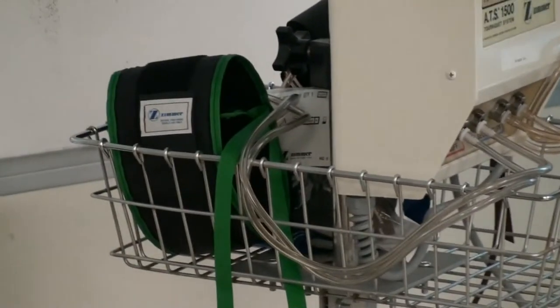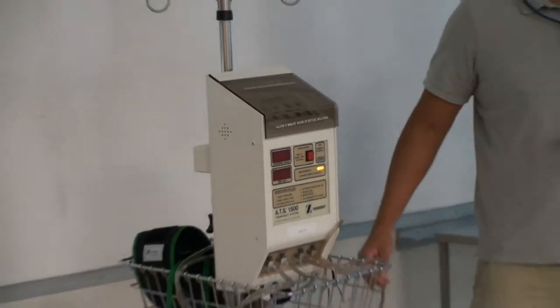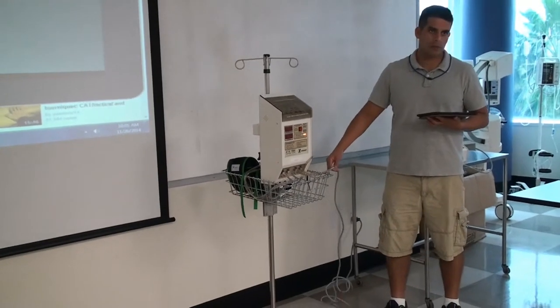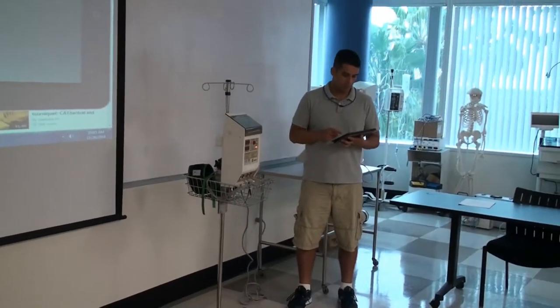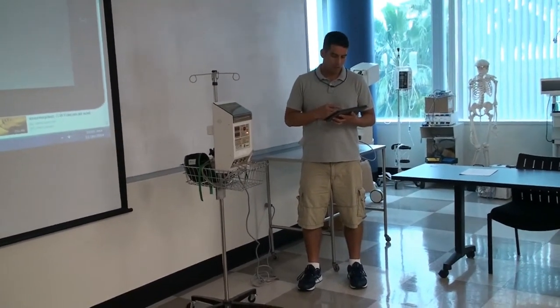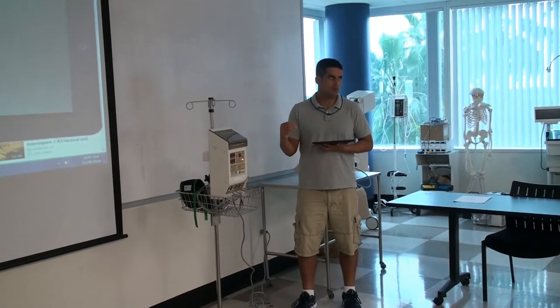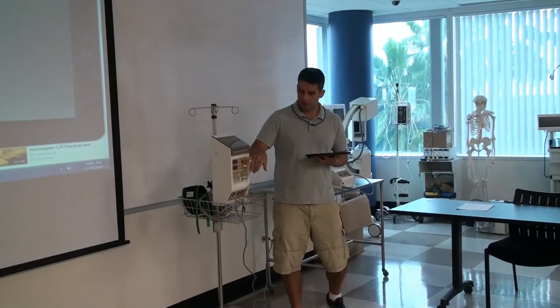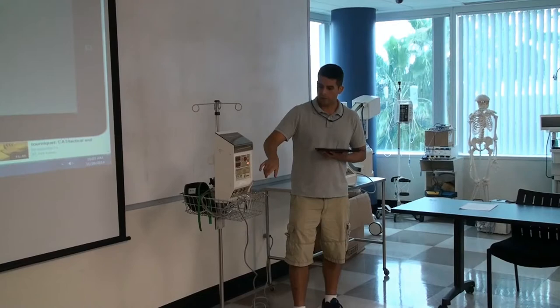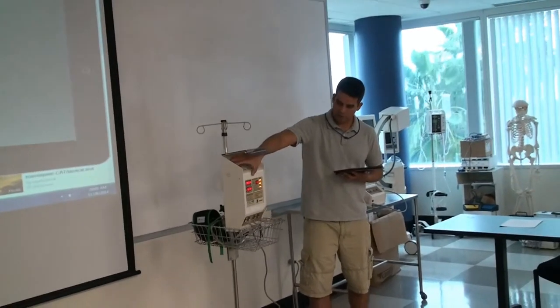For the troubleshooting, loss of power: one of the main reasons can be that the cables attached to the power supplies are in bad condition, or one of the fuses just blew out. When you have no indicators on, or tones, there is a series of steps that we're going to see in the hands-on training. That comes from the alarms and all the displays that you can see in the equipment or in the unit, as you can see here.